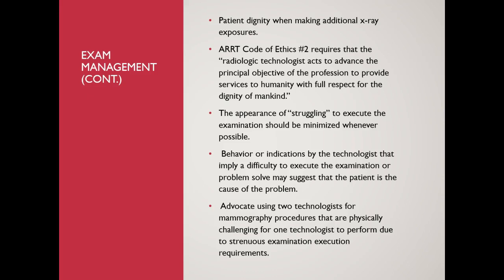We need to carry on with complementary views or additional views as if it's just part of our day-to-day process. Advocate using two technologists for mammography procedures that are physically challenging for one technologist to perform. So don't feel like you have failed if you need to go enlist help from a fellow tech.